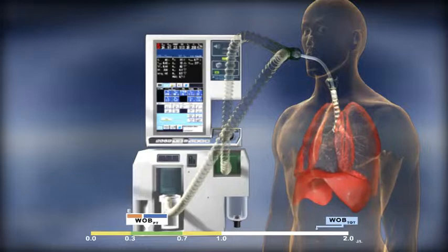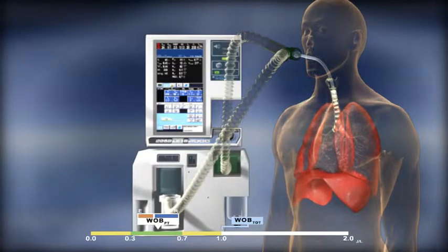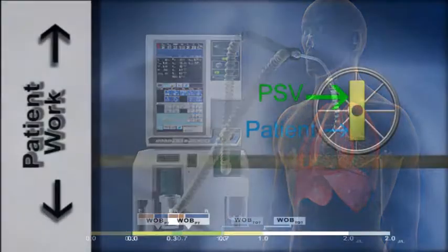Once the underlying pathology has sufficiently reversed and the associated work caused by these initial changes reverses, we will see the total work and patient work decrease. This, coupled with clinical assessment, would indicate that a reduction in percent support is allowable. This change allows the patient to assume a greater percent of the total work associated with breathing.